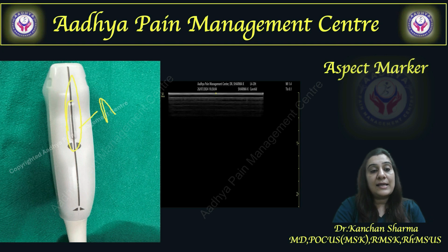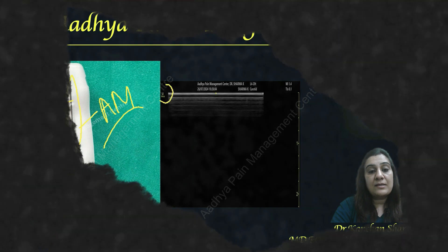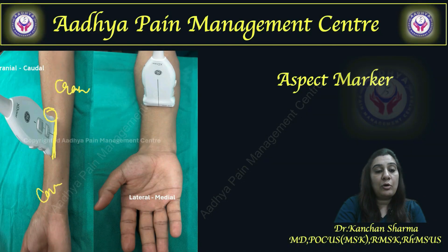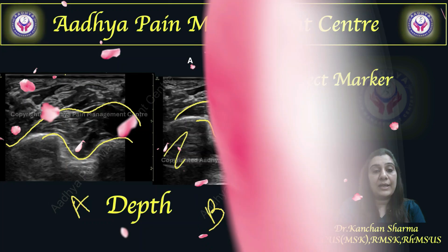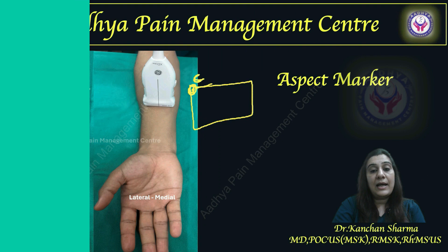This is the aspect marker on my probe, and the same thing is indicated on the screen. If I am looking at the screen where the aspect marker is, this side will become cranial, as you can see here.